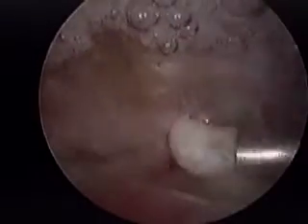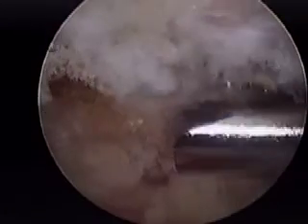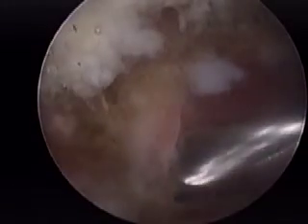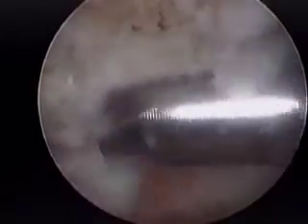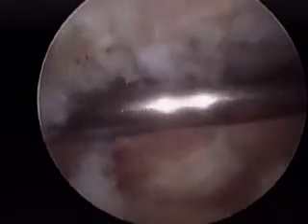So then we would have to perform the Mumford procedure. Now we are working from the anterior portal. Now we are removing the inferior part of the very distal clavicle, and now we can see that the inferior part has been removed, but not the superior part. At this moment, I always like to pass a Kirschner wire that's going to guide me to enter the posterior part of the AC joint.